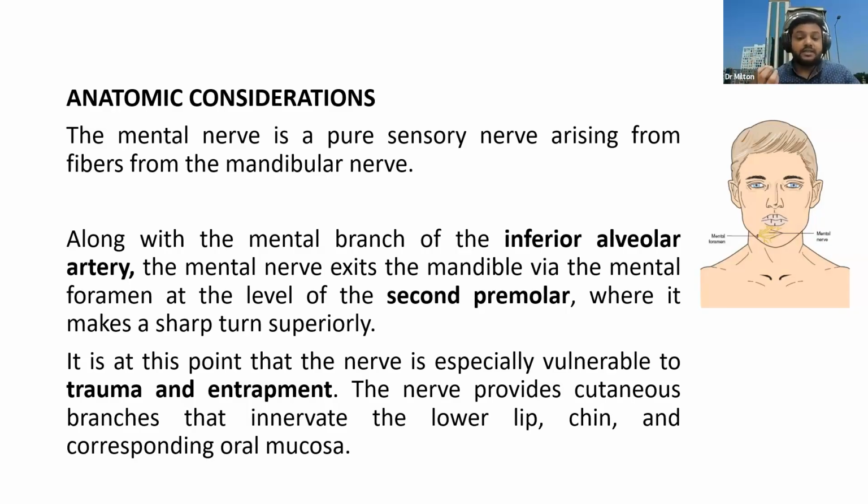If there is a traffic accident or direct trauma, or any tight something, it causes entrapment of the nerve. If there is any tumor or something under your ultrasound, you should compare with the other normal side.